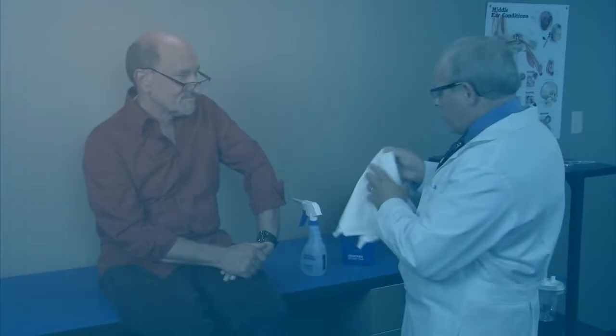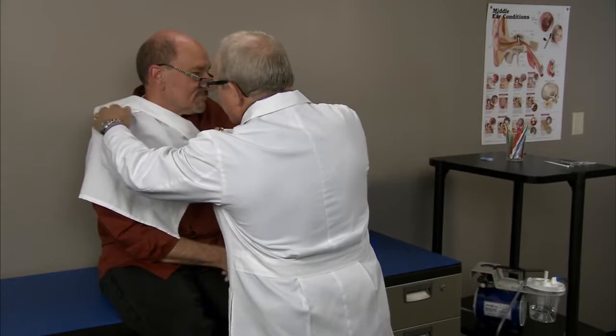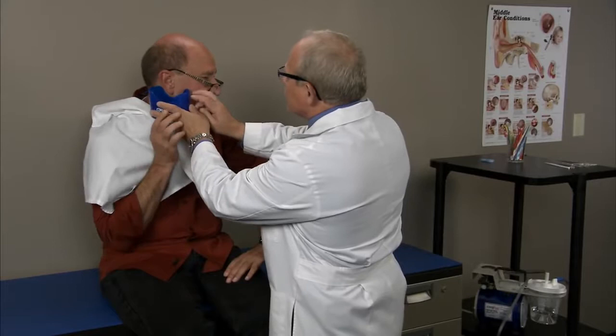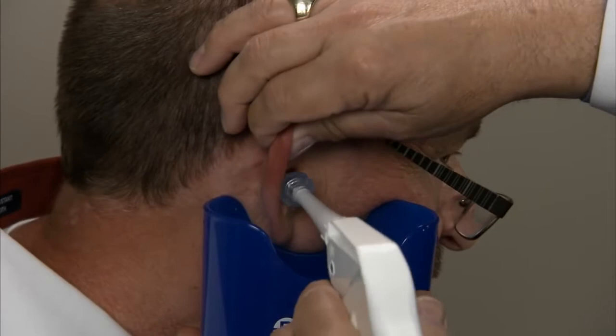What we're going to use is just a simple drape here. It's not necessary to get real extravagant with the draping since the water isn't coming back, so I just like to put a towel over the patient's shoulder to catch any drips. I'm going to ask you to put this against your head just like that and hold it there. The ear basin's cupped so it fits nicely under the ear and keeps any drips from coming down onto the patient's clothing. So we just put it in there, that's okay? Yeah. And we just begin irrigating.